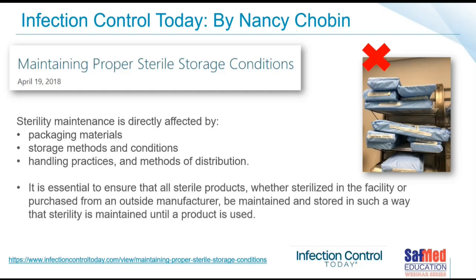It is essential to ensure that all sterile products, whether sterilized in the facility or purchased from an outside manufacturer, be maintained and stored in such a way that sterility is maintained until the product is used.